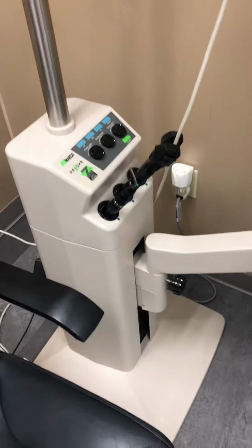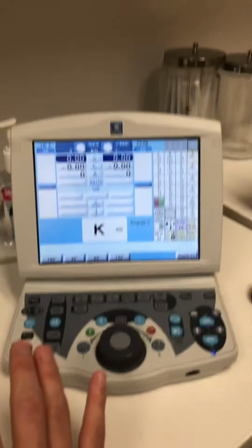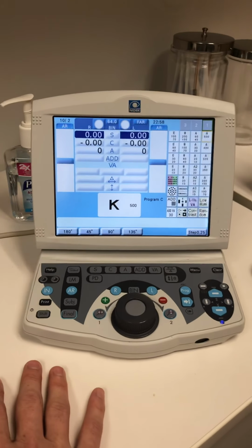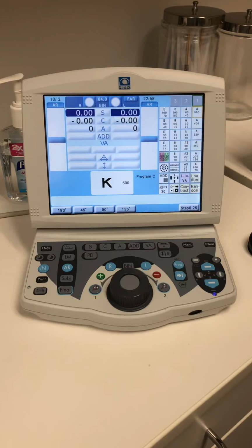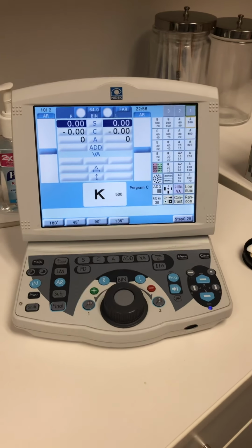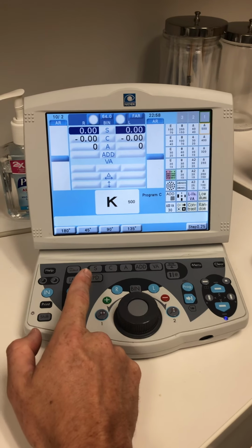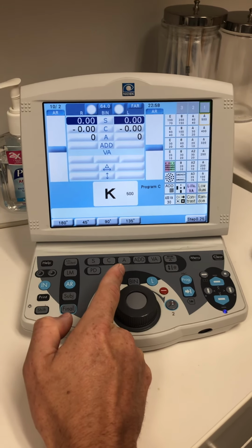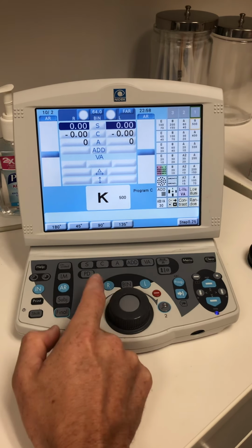Standard stand here as well. Buttons, all that good stuff. Just to get started with the tutorial on the Phoropter, it's a carbon copy of what a regular manual Phoropter is, just with buttons. Right now you have your S for sphere, your C for cyl, your A for axis, and your add power will switch to an add power.